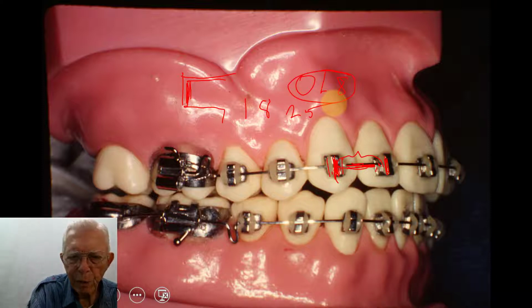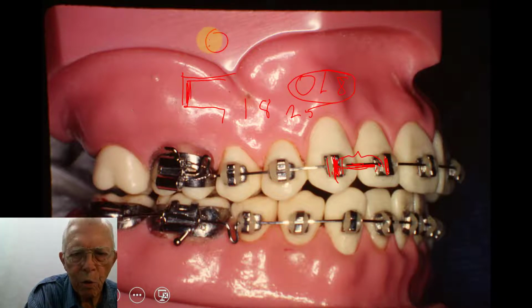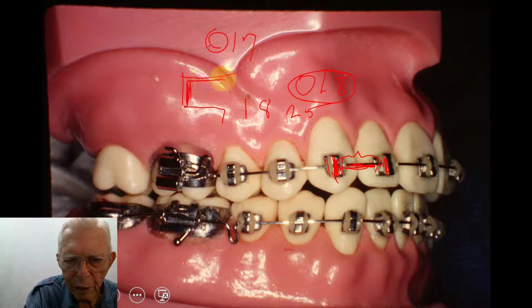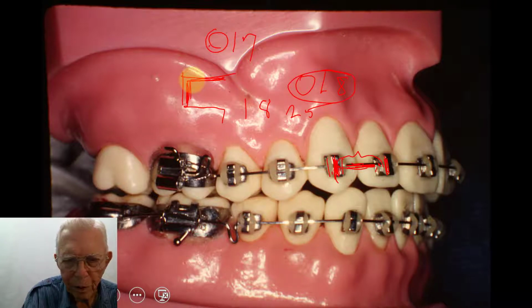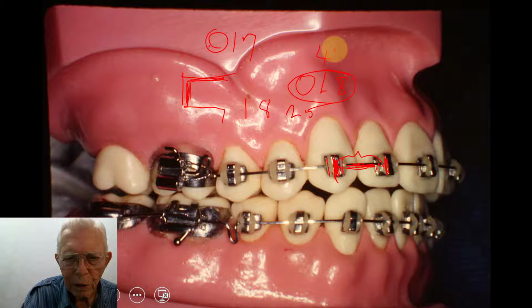Now, most of the time we use rectangular arch wires to do the finishing work, and the rectangular arch wire that I use is an 017, 17 thousandths instead of 18 thousandths. In other words, I've got a clearance in here of about a thousandth, and that reduces the torque that's in the bracket by about 4 degrees, so you don't have quite as much torque. So in some of them I have to add more torque than I want.